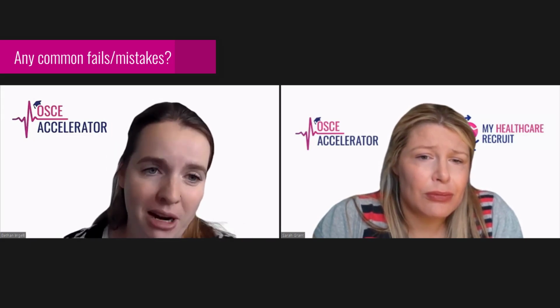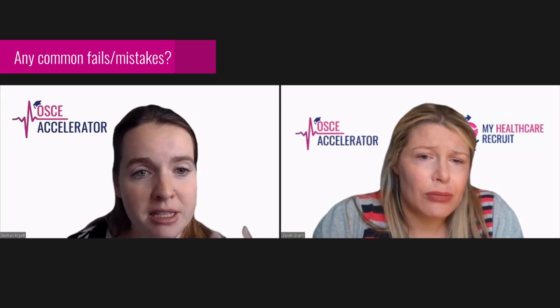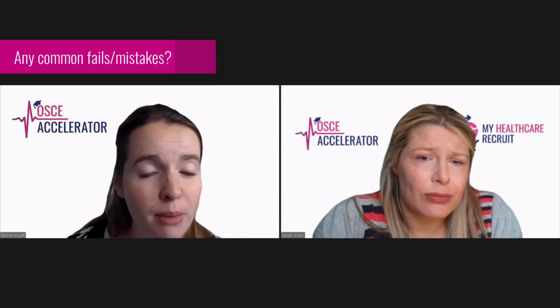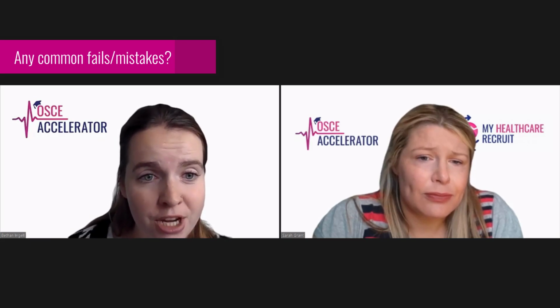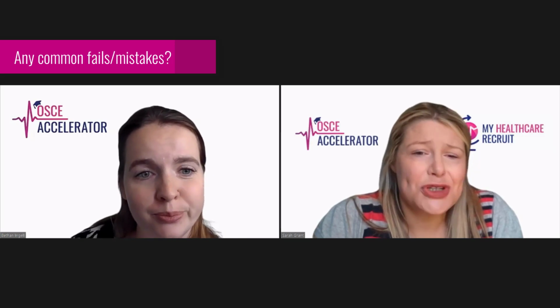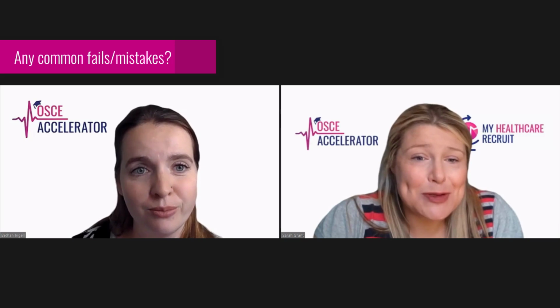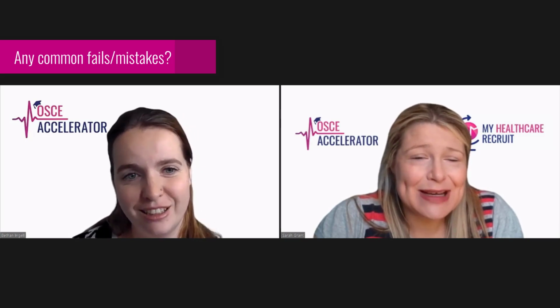It is bad practice anyway, so make sure you've removed all the water. Also, as I said before, candidates not being familiar with how to use the catheter and things going wrong with that. Sure, so just being as prepared as possible in that respect.